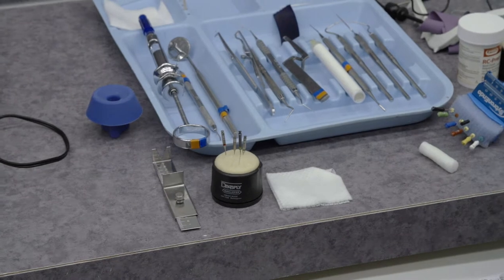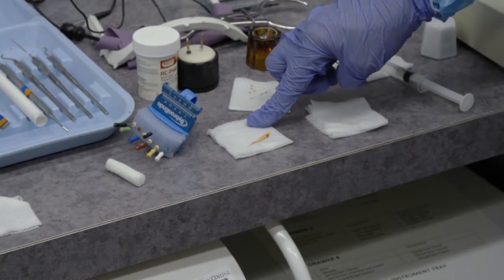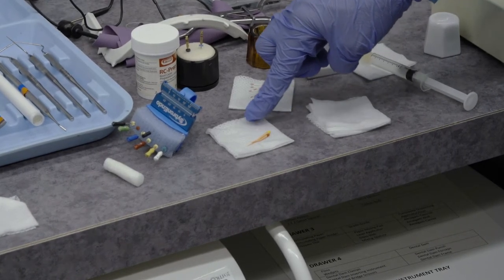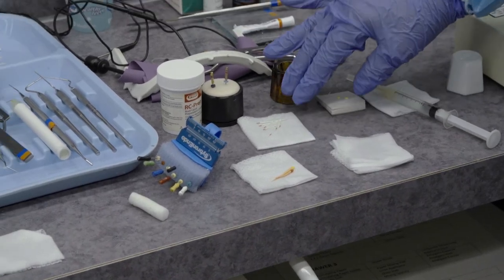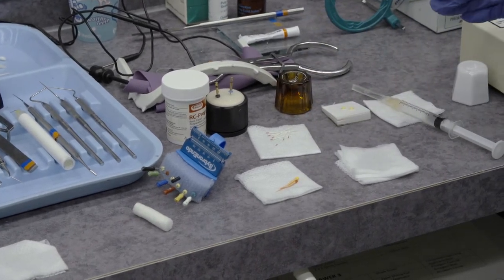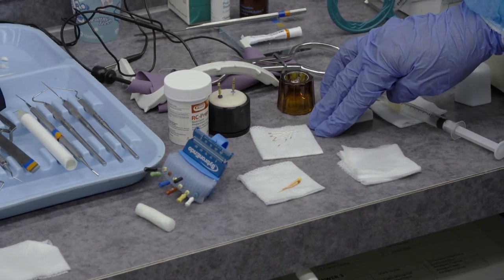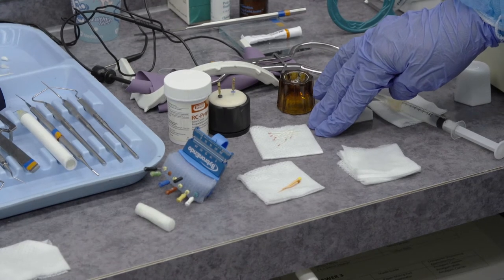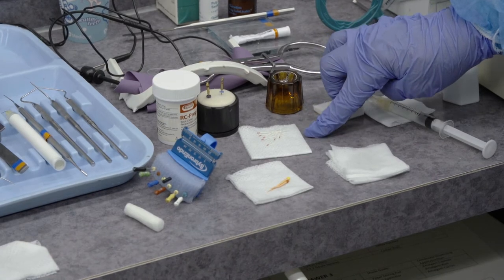We have here the gutta percha, which is ready. The gutta percha, the dentist will determine the size, but I have two sizes sitting here on a 2x2 that is soaked with sodium hypochlorite. Next to the gutta percha, I have the paper points. And paper points come in different sizes, and if you note, the paper points that are taken out here are red on the tip. That actually determines the size of paper point to be utilized. In this case, the red would be a size 25.